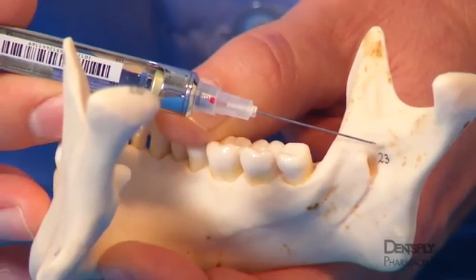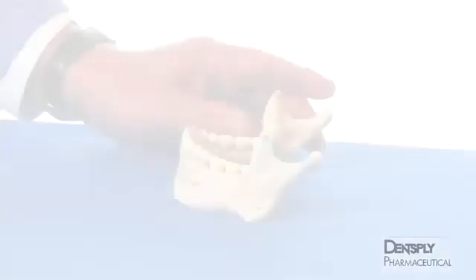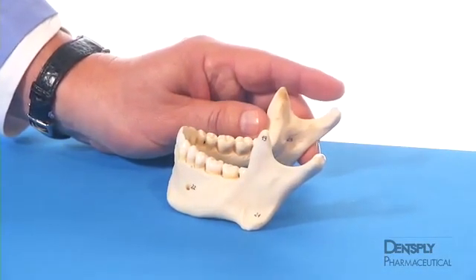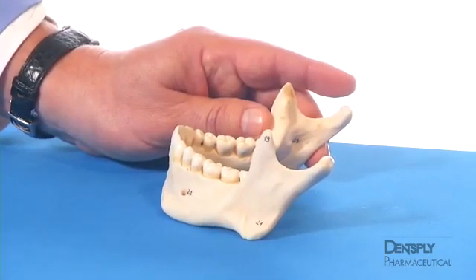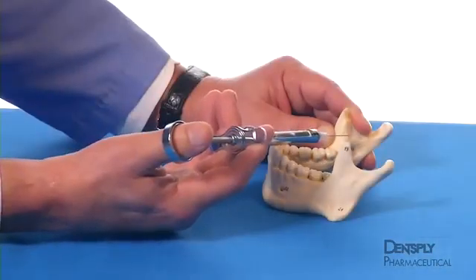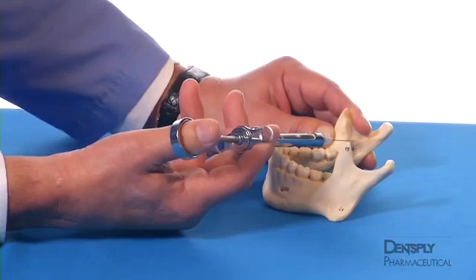Intraoral landmarks are key to this injection technique. The height of the injection is established by the greatest depression of the ascending ramus, the coronoid notch, a concavity on the anterior lateral border of the ramus. With the syringe held parallel to the mandibular occlusal plane and at the level of the coronoid notch, the needle will be in a plane that intersects the mandibular sulcus unimpeded.